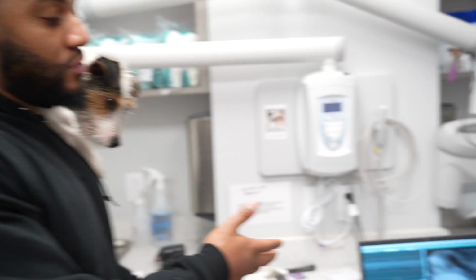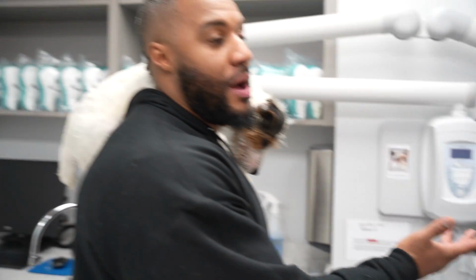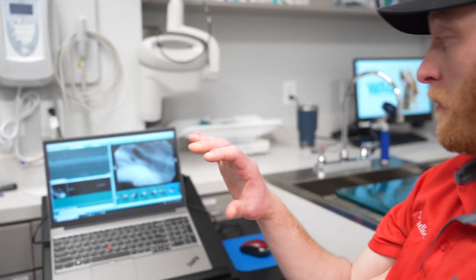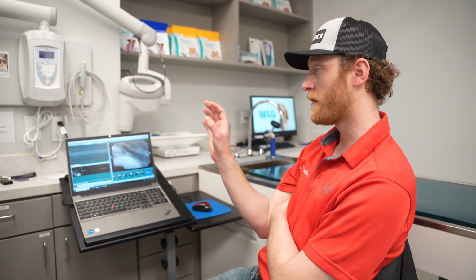So this goes back to, definitely, a pre-op thing. Most of my patients are under anesthesia. I tell them to go ahead and shoot the x-rays and then start cleaning them. It's really just like going to the dentist. The only difference is dogs and cats are under anesthesia and we're not.